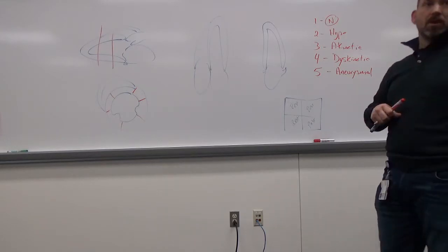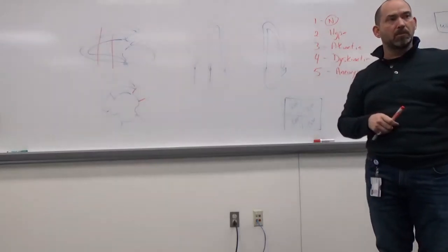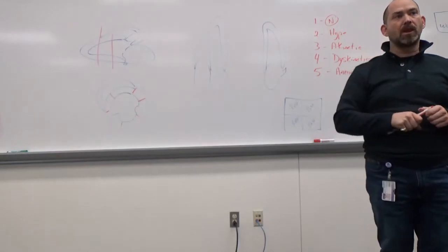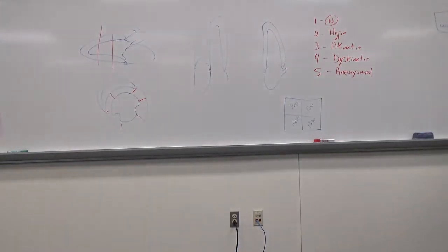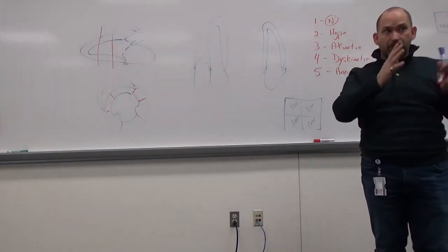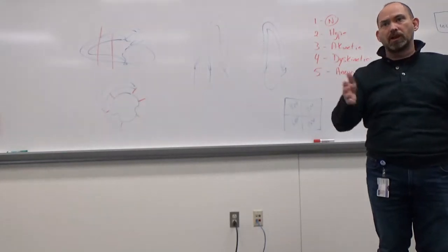After the exam, you're going to take all the clips within the parasternal long axis, find the one that's the best, and select that one. Then you go to the parasternal short axis, do the same, etc. That way you represent all the best images you can get. So it's going to take multiple clips throughout. It's not like you only have one shot at each view. Which is nice. Some systems I can jump back and forth on. Other systems, once you change views, that's all you can do for that view.